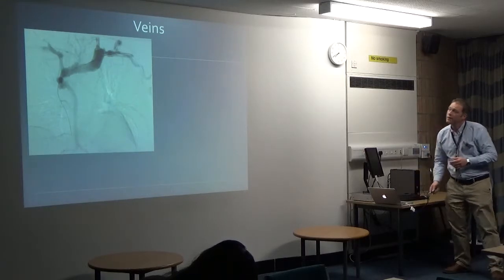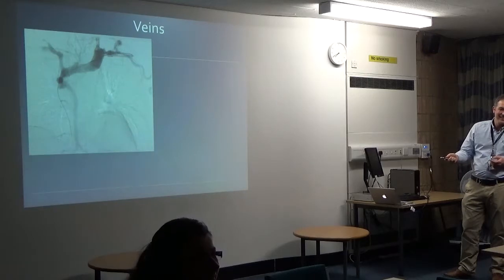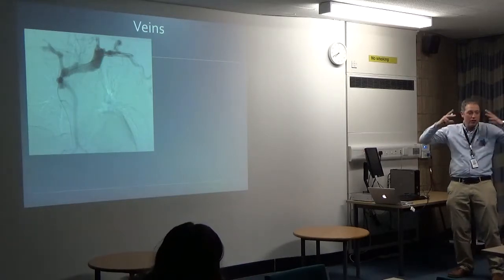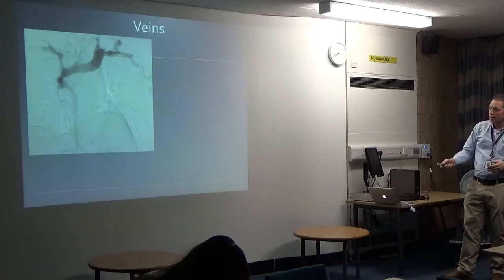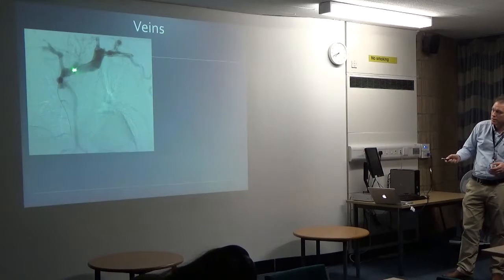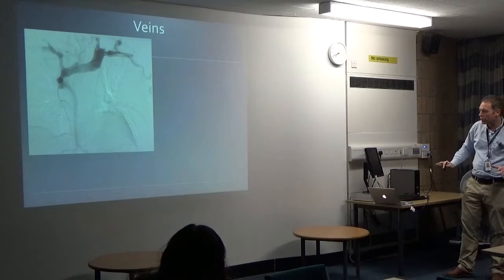Now this, I'll ask Mr. French what do you think this is, Mr. French? So this is the heart. This is a patient with really marked head and neck swelling, awful head and neck swelling, and this can often be due to cancer, not necessarily liver cancer, but other cancers. And this is a vein that should be there in the chest but isn't there, returning blood to the heart. So this patient, all this blood's trying to come back from the patient's head and arms and can't get through. So you get lots of head swelling, arm swelling. It's really horrible for the patient.